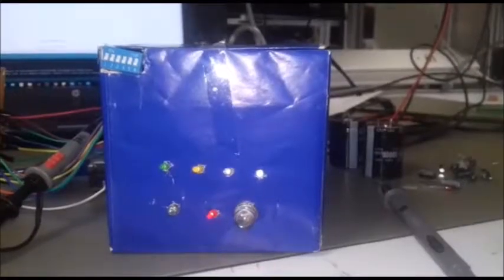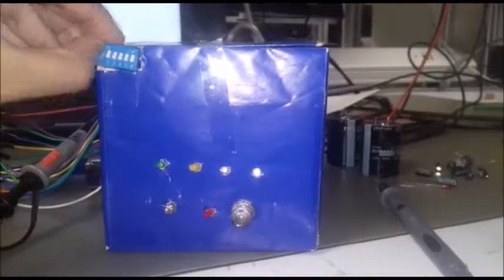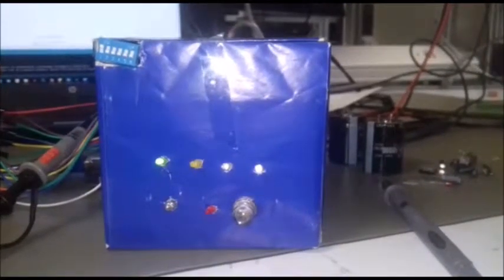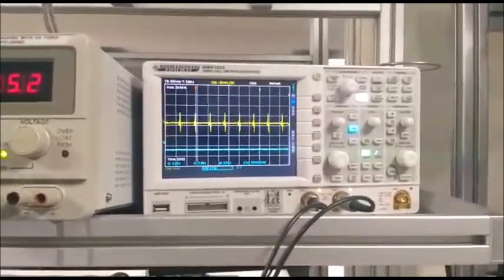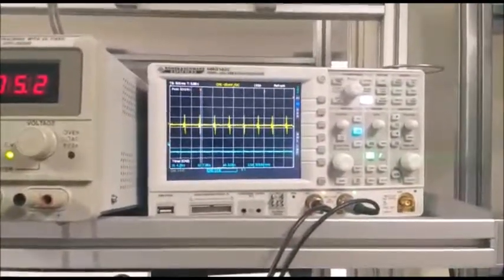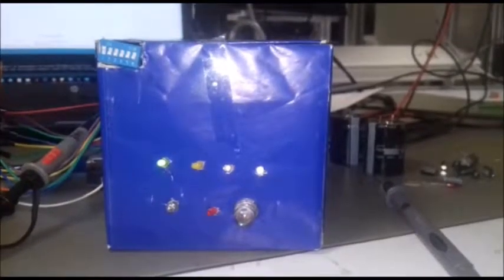This is the operation selection of the first patient in the dip switch. Position 1 is placed and it is observed that during the whole process the green LED is illuminated. In the oscilloscope, the signal is normal and it is read during all the time that this position is selected.